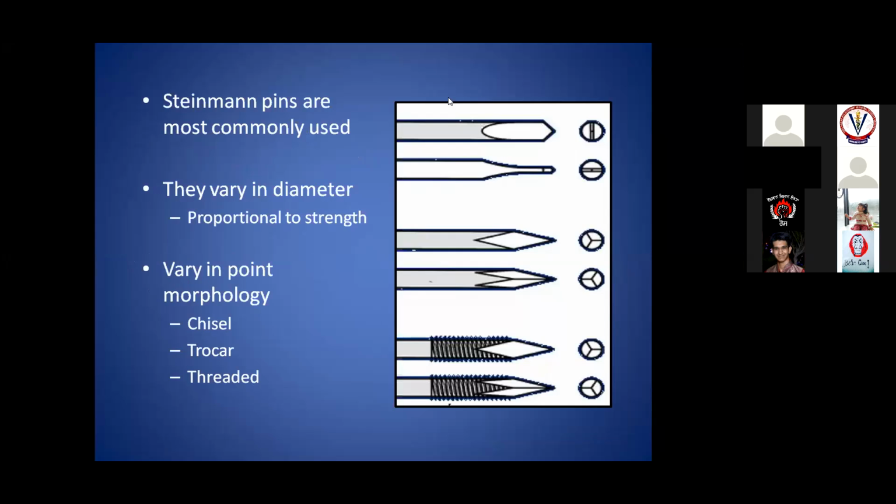Now, these Steinmann pins are available in different sizes, based on the diameter. They are also available in different lengths. You can select a pin of whatever length you want, and the extra length of the pin can be cut snugly to the bone with the help of a pin cutter.